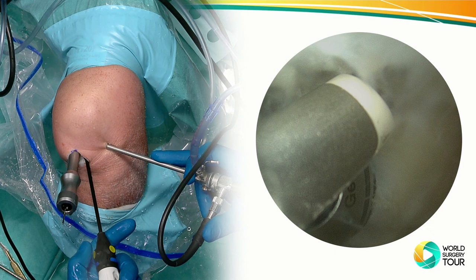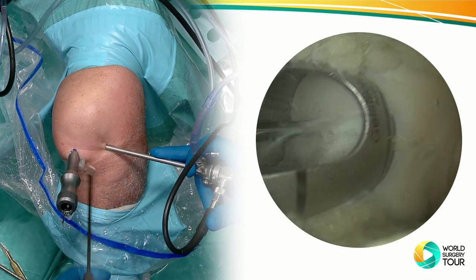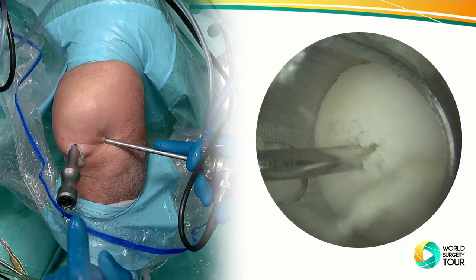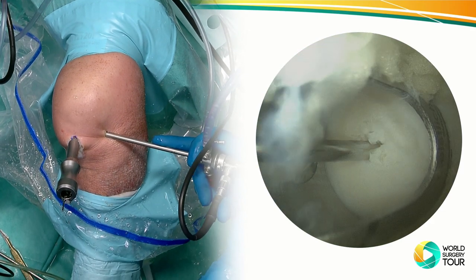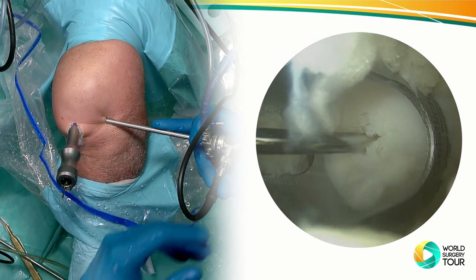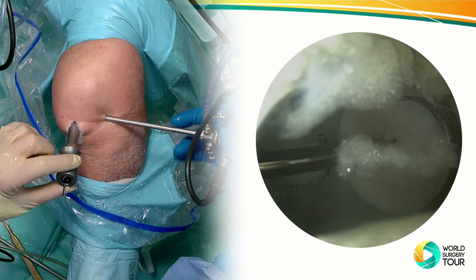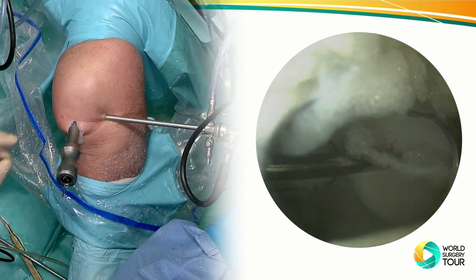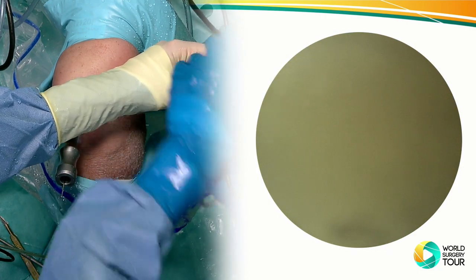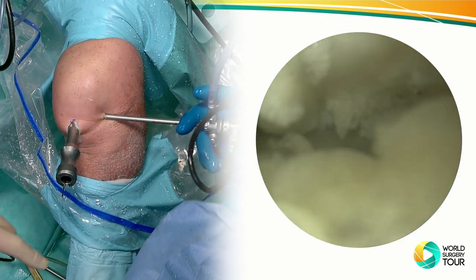As you can tell, I like to take this second, but you can see a little bit more. Okay, here we go. So now you see the wire, it's actually perfectly placed in the center of the defect. You can see the defect, and now we need to remove the cartilage, ideally to collect the cartilage, which we eventually are going to use. In order to do that, we would remove the water. Maybe put the second wire in here to hold it in place, if you want to. I'm going to do that in a second.